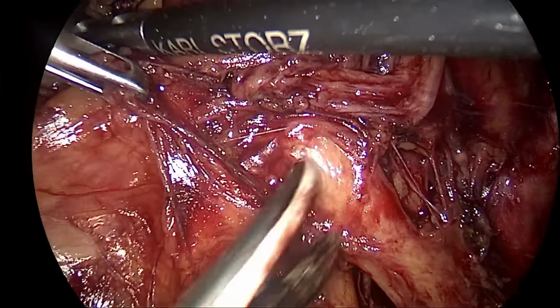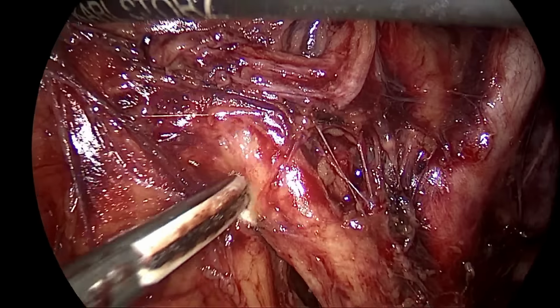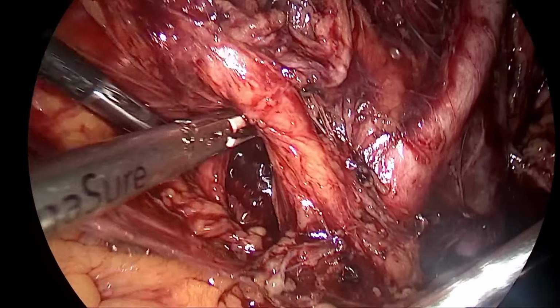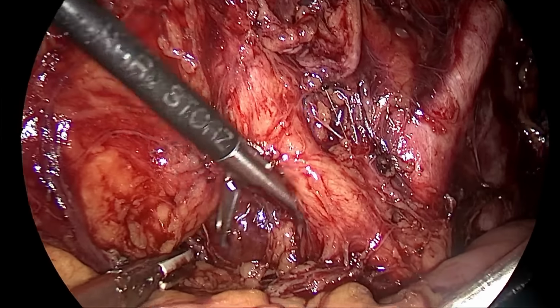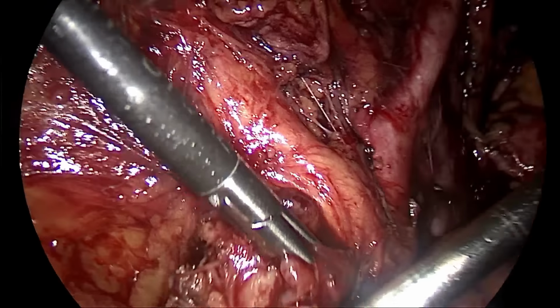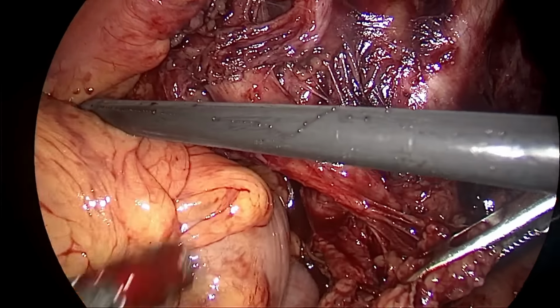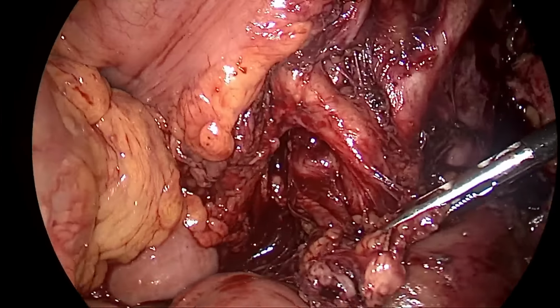You have to be very careful in this plane regarding the ureter. The ureter will be 1 to 2 centimeters below in this plane. So that's our ureter. So I'm trying to lateralize the ureter, and that's the big node. The part of the node was removed from below. Now we are pulling the node upward so that all of that chain will be cleared off.